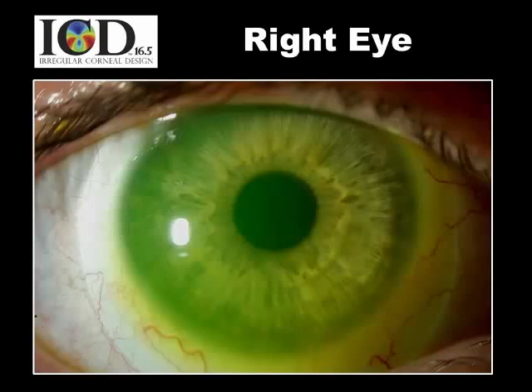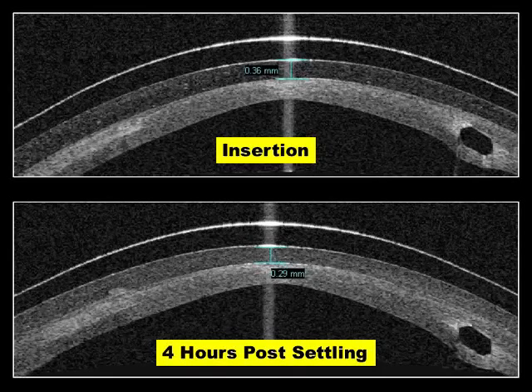And then we align the lens out here in the far periphery, creating stability in the fit, creating centration, and creating comfort. Now ideally, when the lens goes on eye, it should have between 300 and 400 microns of apical clearance on insertion, and that's simply to allow for the normal settling that happens.